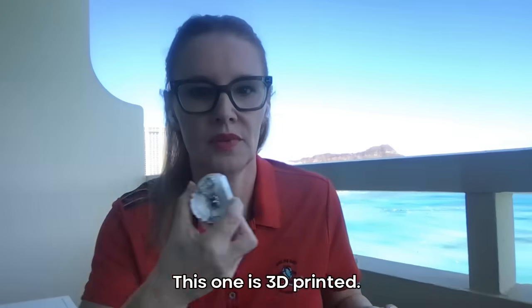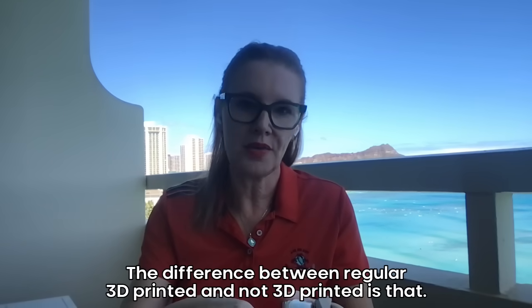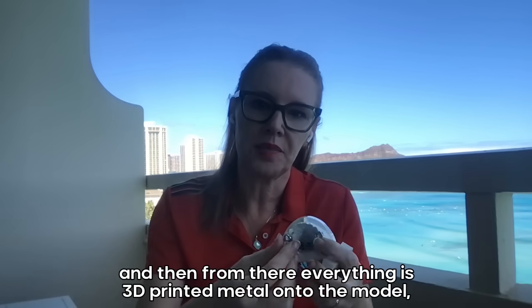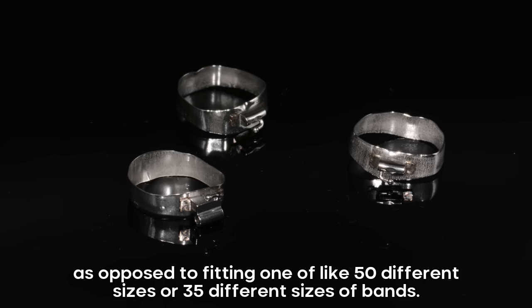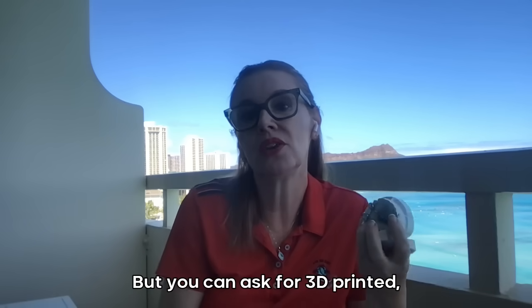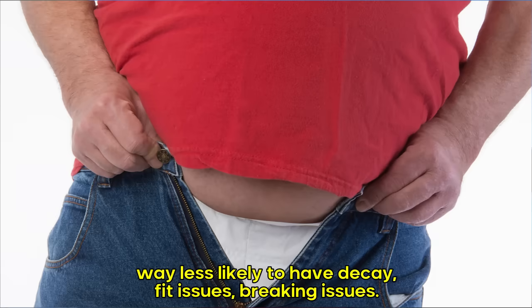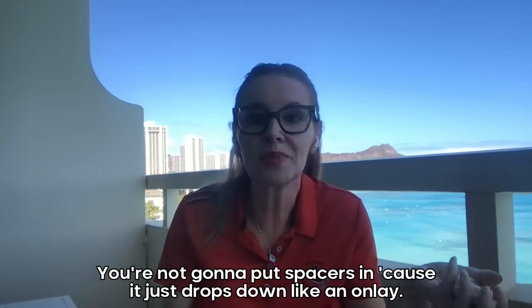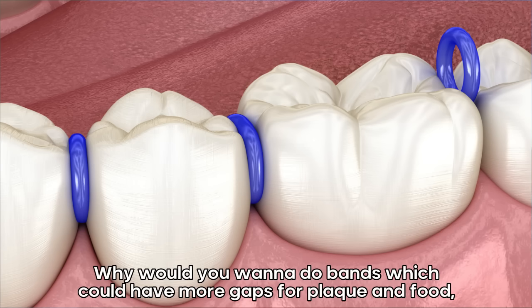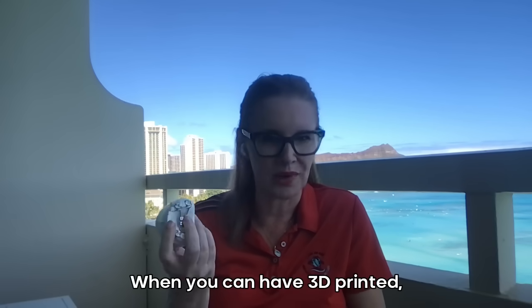Or you can ask for a 3D printed palatal expander. The difference between 3D printed and not 3D printed is that it's a 3D printed model, and then everything is 3D printed metal onto the model, as opposed to fitting one of like 35 to 50 different sizes of bands and finding the right band to fit. That's the analog way — that is how most labs do it. But you can ask for 3D printed, which costs a little bit more. Way better fit. Way less likely to have decay, fit issues, breaking issues. You should always pick 3D printed — it's a no-brainer.